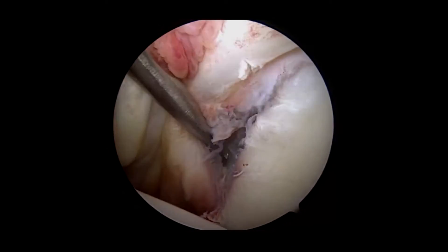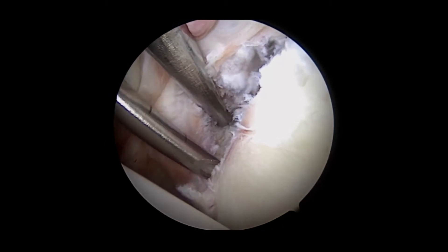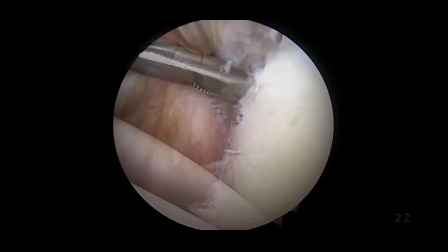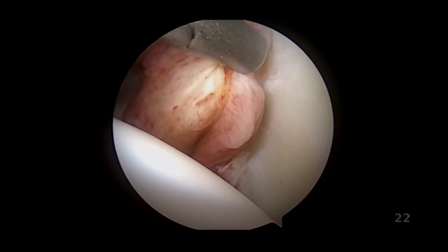With the use of an oscillating burr, or alternatively a rasp, the glenoid neck is fully freed from soft tissue until a bleeding surface is established to facilitate bone-to-capsule healing. A small arthroscopic atraumatic grabber device is then used to demonstrate full mobility of the capsulolabral tissue.